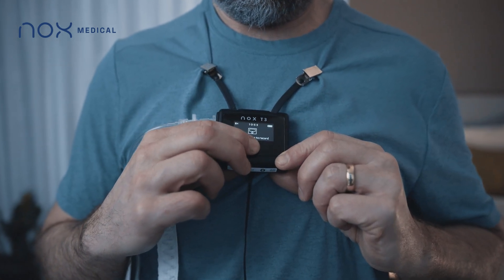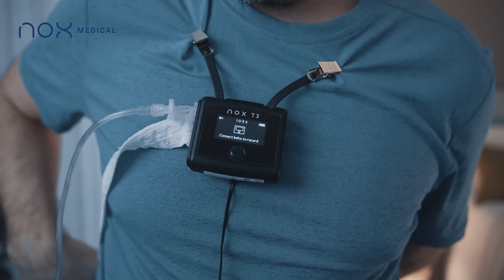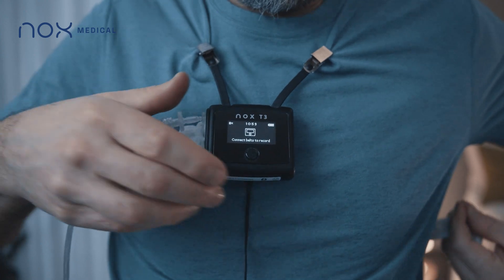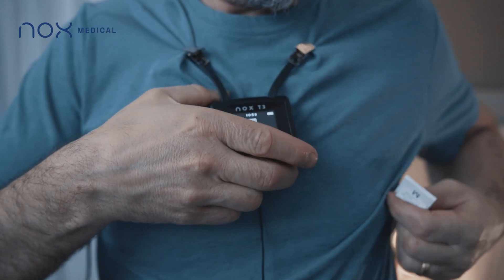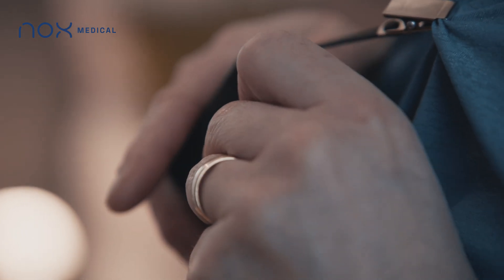Take one belt and snap it to one of the connectors on the back of the T3 device. Then arrange the belt around your back. Make sure the belt is not twisted. The device will automatically begin recording once the belt is securely connected.